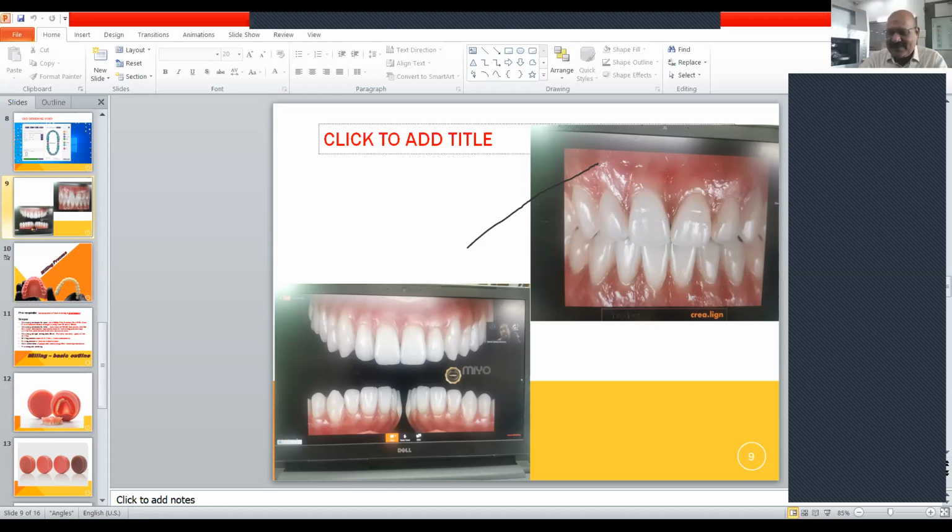But here, if the material property is such that it will reduce the anxiety of the clinician, unless the patient has some other clinical problems. Since it cannot be repaired, it cannot be used as a transitional prosthesis. And since it cannot be relined and repaired, we need to be very careful about the residual ridge resorption state. If we have a freshly extracted case, a patient with 5-6 extractions done 2 months back, all posteriors, then we'll have to think twice about giving PEEK.